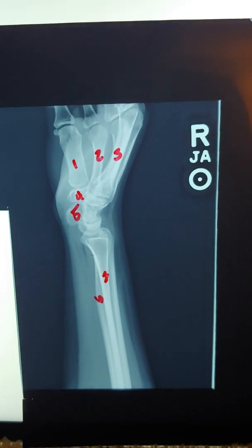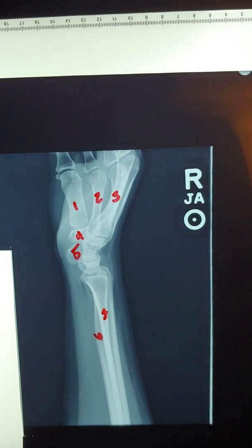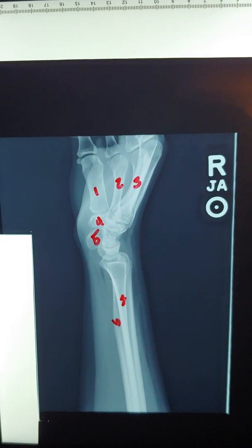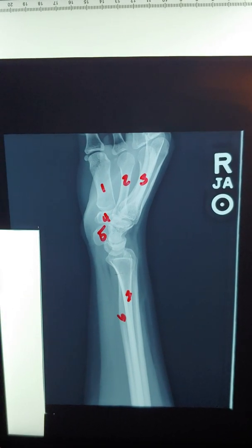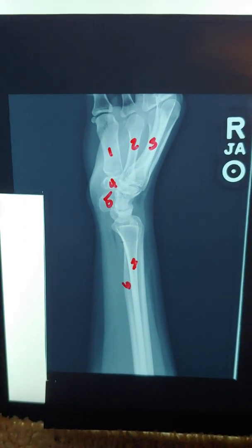I did not need to use any immobilizations or any other equipment. I had no challenges or had to make any adaptations to the exam. After showing these images, they are of positioning quality, so they are diagnostic quality.